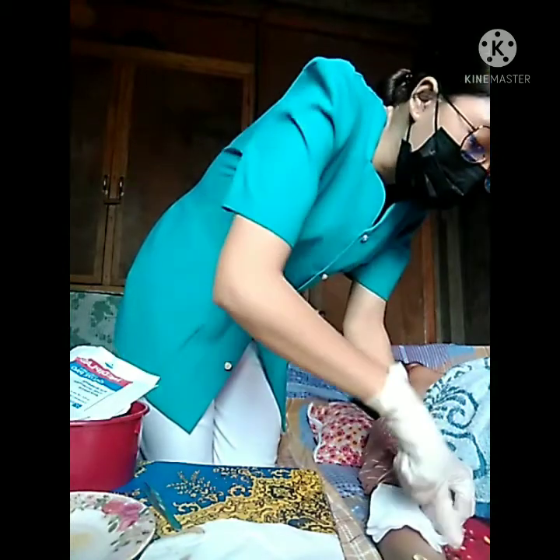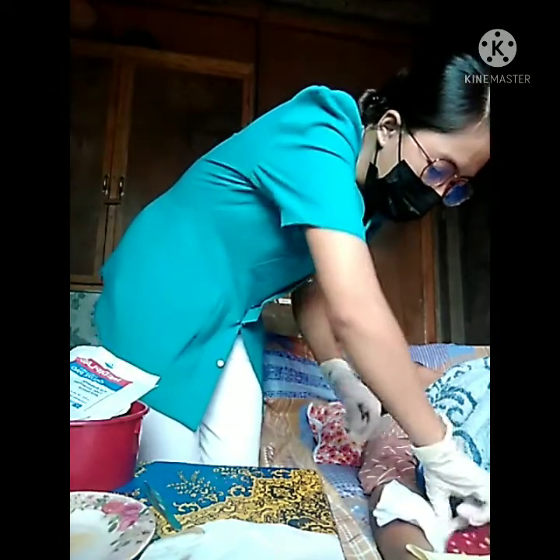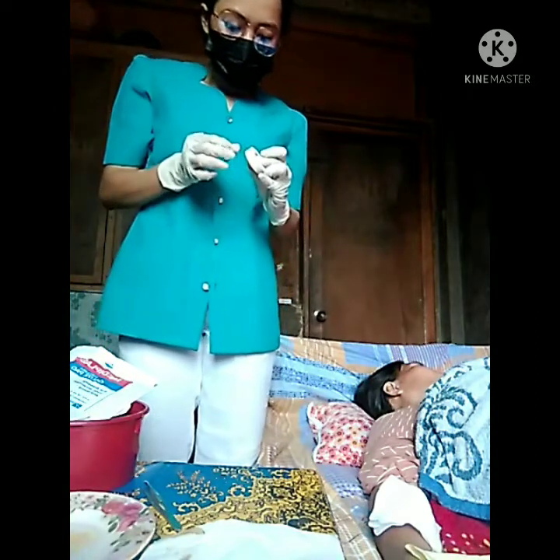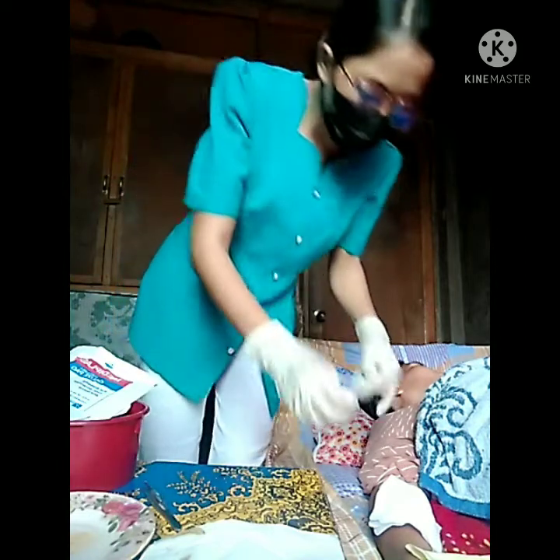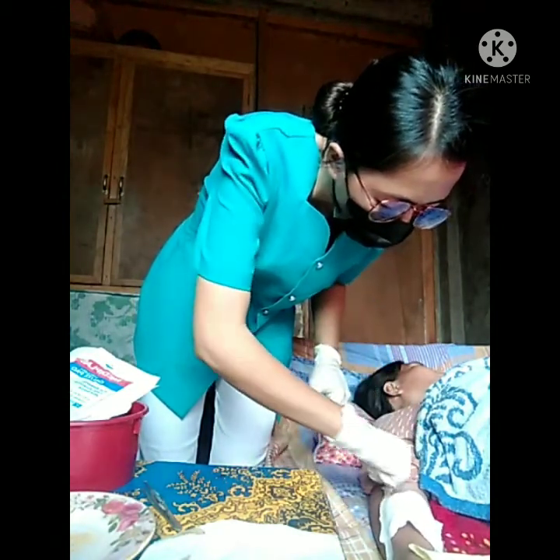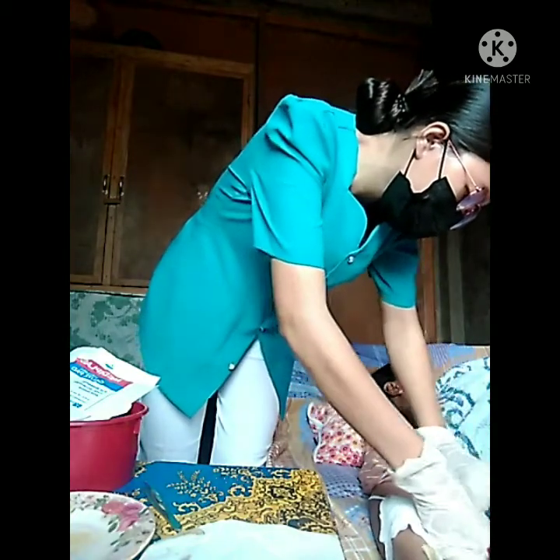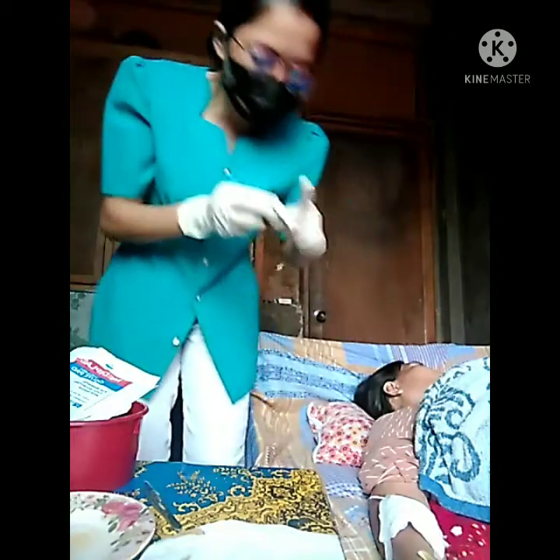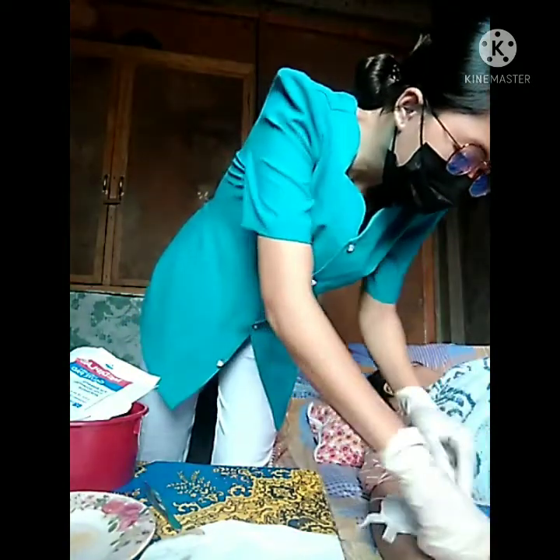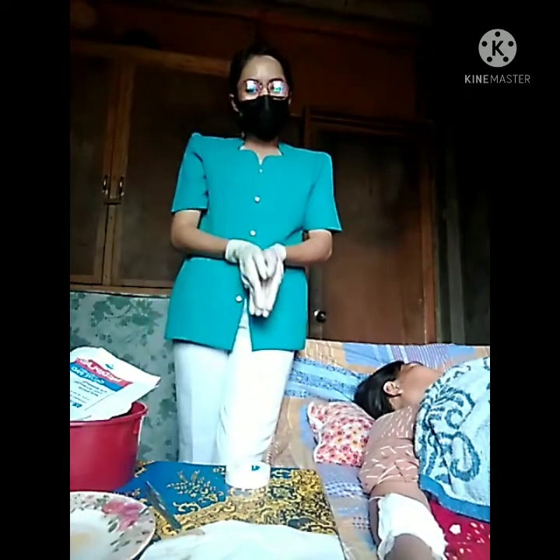So make sure to put the adhesive tape carefully. So that's all for the dry dressing.